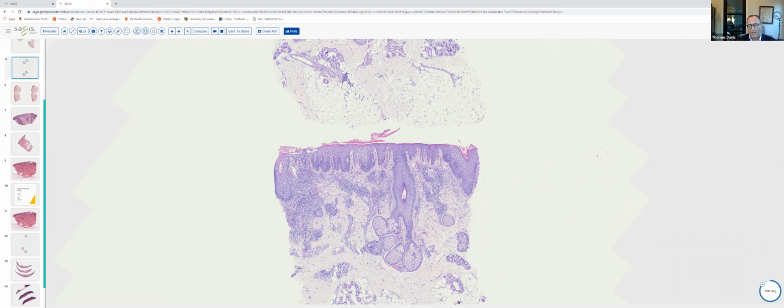And so clinically, the surface of the specimen is going to become crusted. The lesions are usually quite pruritic. Patients tend to scratch them. So we get associated epidermal hyperplasia. And the spongiosis or vesiculation in a subacute to chronic eczematous or spongiotic dermatitis becomes less pronounced.